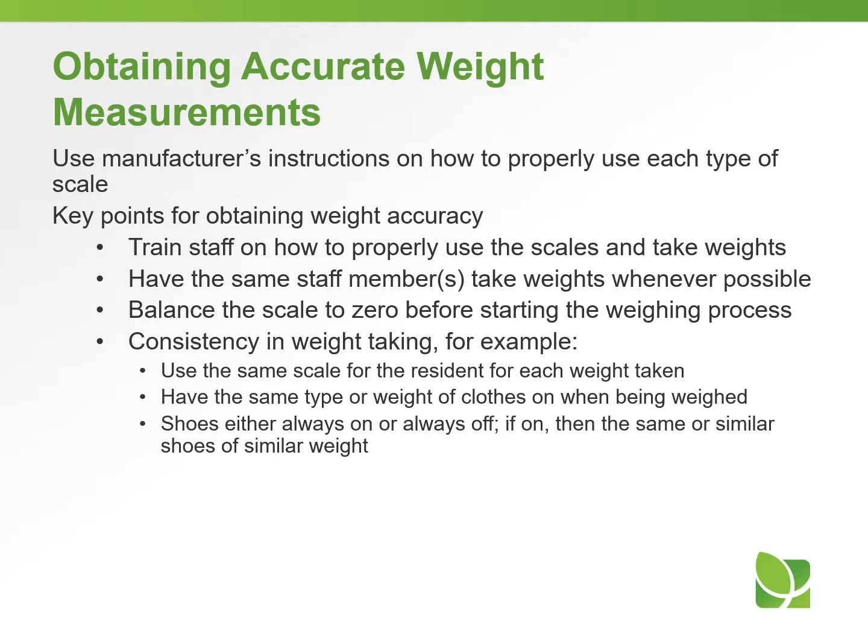Key points for obtaining weight accuracy. Train staff on how to properly use the scales and take weights. Have the same staff member or members take weights whenever possible. Balance the scale to 0 before starting the weighing process.